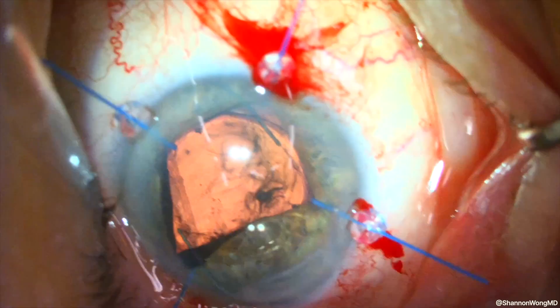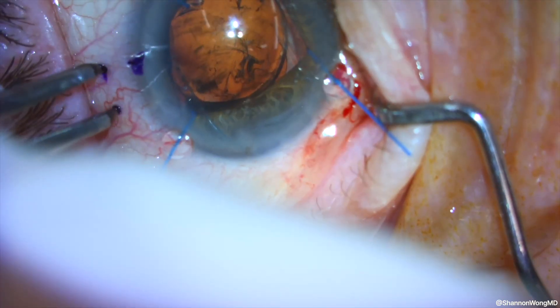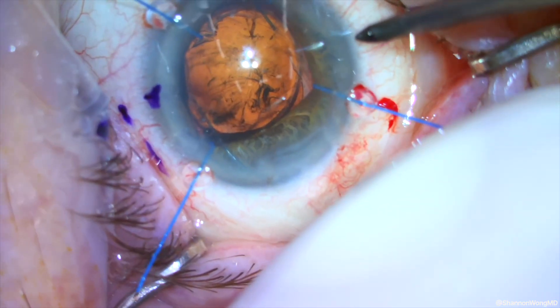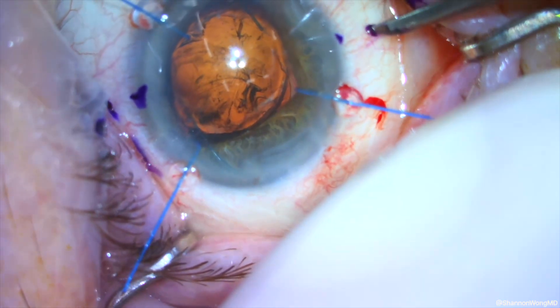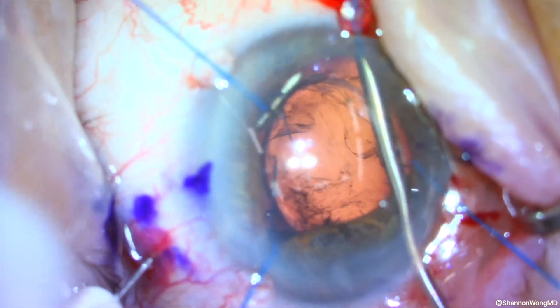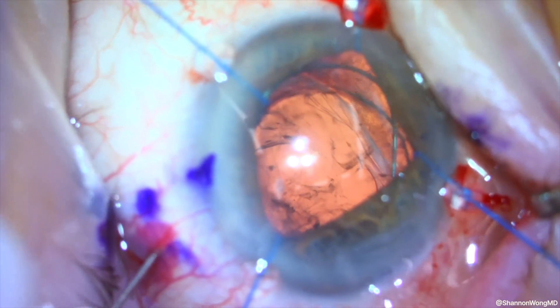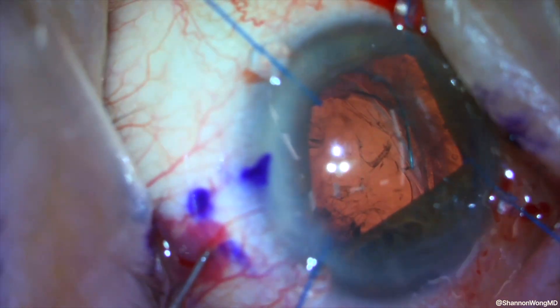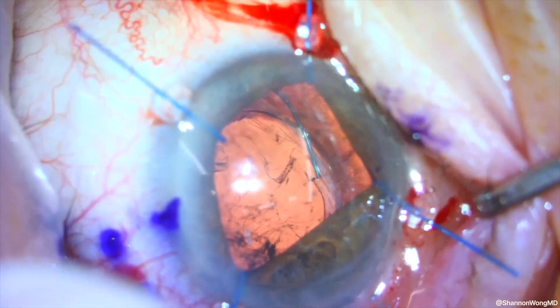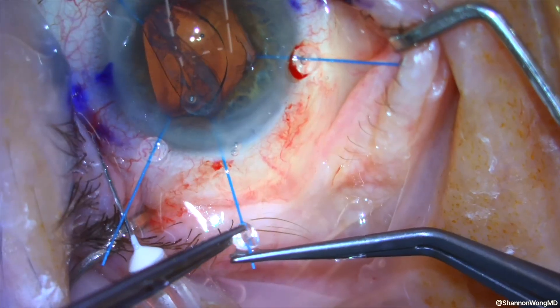We need to get a better view, so iris retractors are deployed to help us see the capsule. We mark the sclera 2mm posterior to the limbus. Since we are sitting temporally, the patient's eyelids are partially obscuring the area of our marks. In retrospect, I should have moved to sitting at the top of the head for better visualization of the sclera at the 3 and 9 o'clock positions. Using a 30-gauge needle, we enter the sclera and feed the leading haptic into our needle. An anterior chamber maintainer is placed at 12 o'clock and another iris retractor is placed at 6 o'clock.